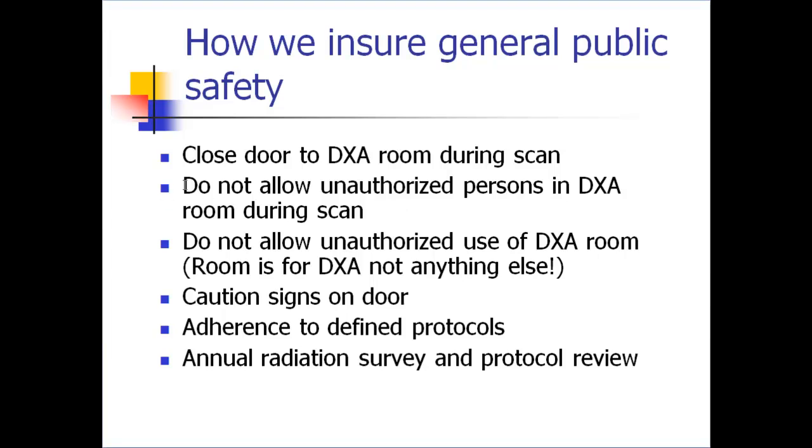Now that doesn't include, let's say, the parent of a child that you might be scanning, the spouse of someone you might be scanning, or in the case of this training, it also doesn't include any of the students who might be training at that time. Don't allow unauthorized use of the DXA room. So the room is for DXA and nothing else. So technically we shouldn't be in there doing skin folds.